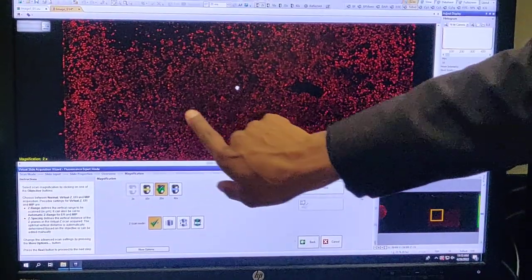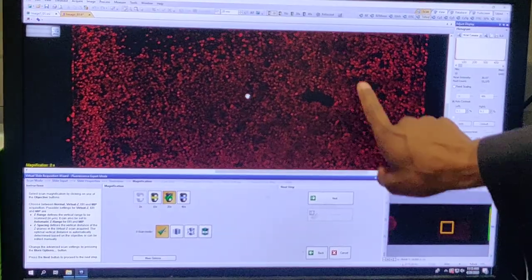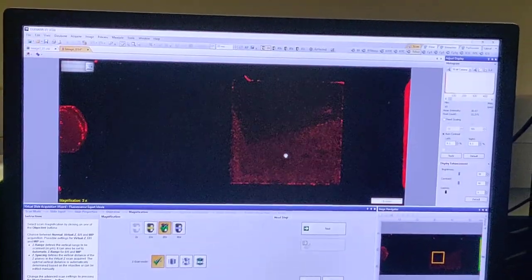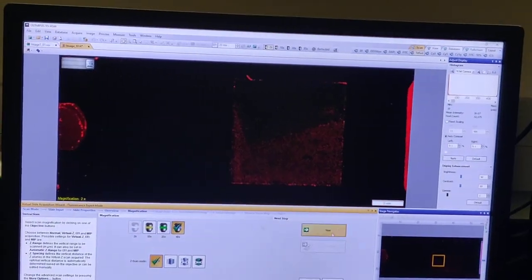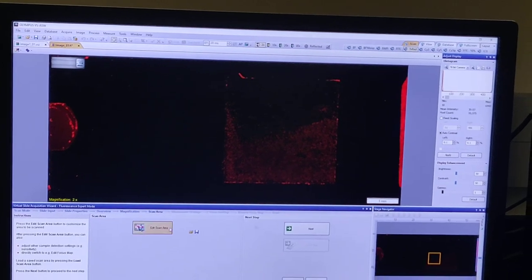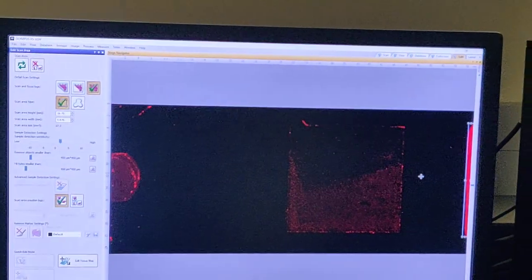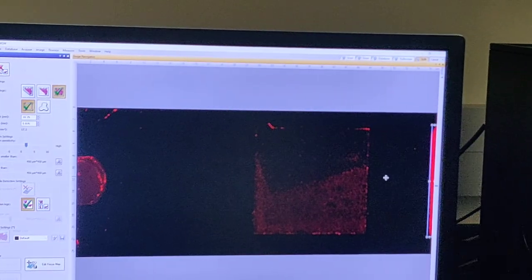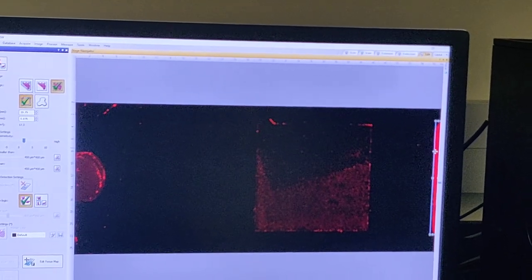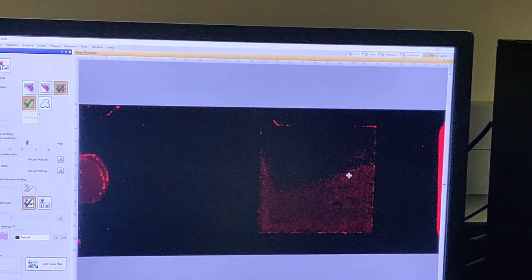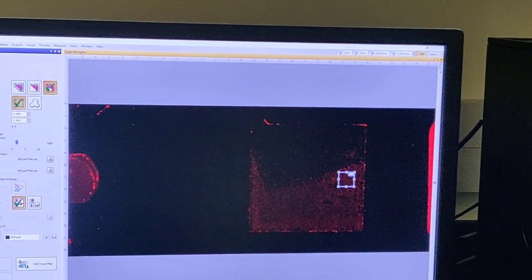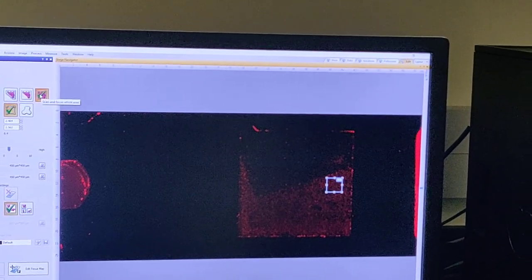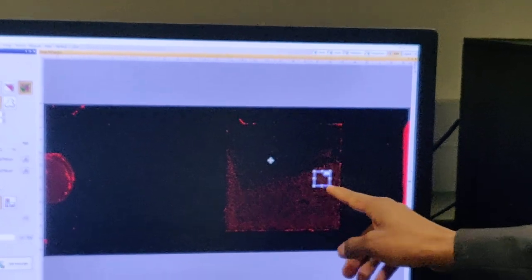These areas have been imaged a lot, so they became dim — I'll pick some fresher areas. Because it's cells, I'll use 40x and position mode. There's a scan area shown; it picked up some random object that I'll delete. I can draw any region of interest. This time I'll scan and focus on the whole sample because it wasn't able to identify the object well. You can draw multiple boxes — 10, 50 — as many as you want.